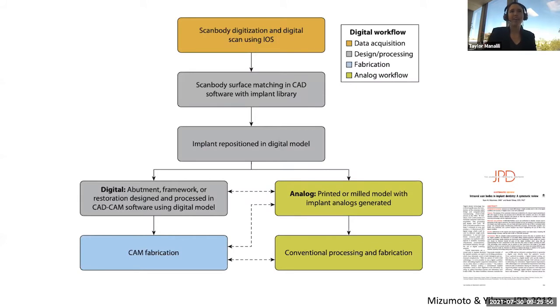So this is whether you're doing the direct workflow or indirect workflow. This is just a nice overview of what happens to your impression when it comes in, right? So we have our scan body. We're digitizing it using an intraoral scan, right? Then the scan comes to the lab.